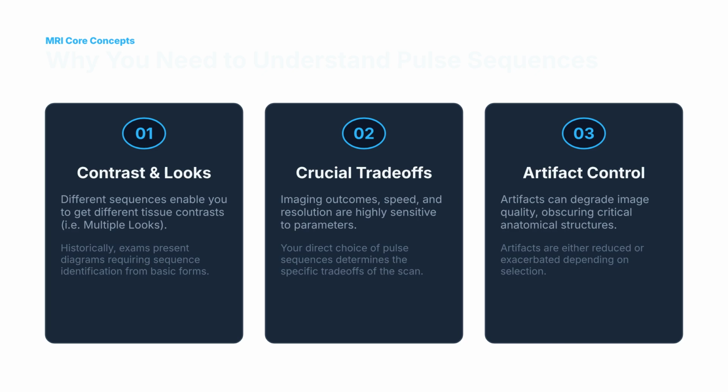Understanding pulse sequences is crucial for mastery. It allows you to control image contrast, manage critical imaging trade-offs like speed and resolution, and proactively handle potential artifacts to ensure high-quality diagnostic images.